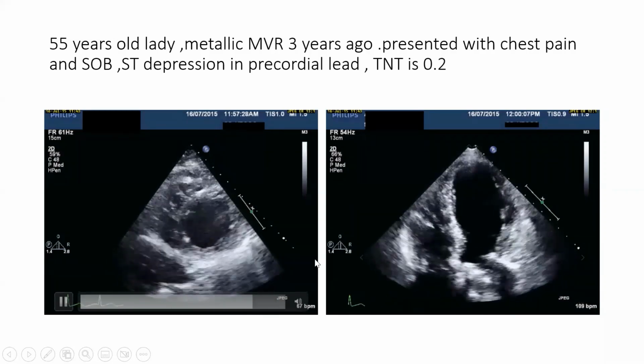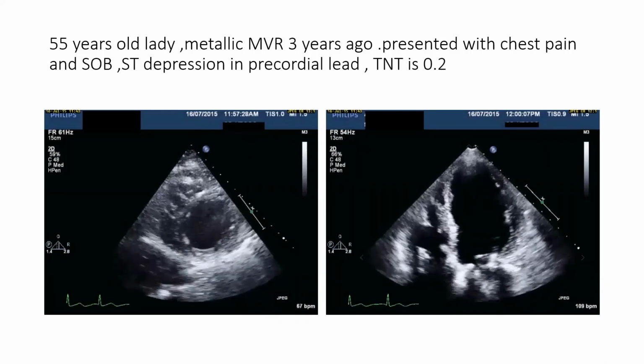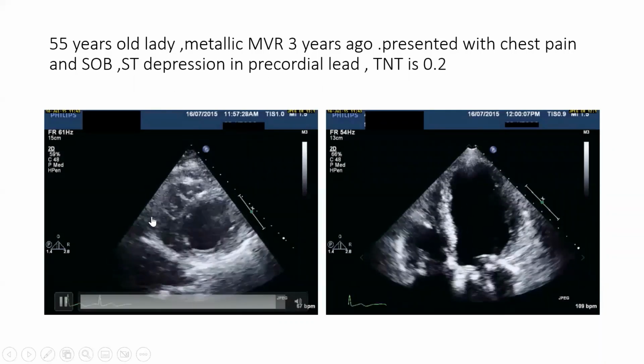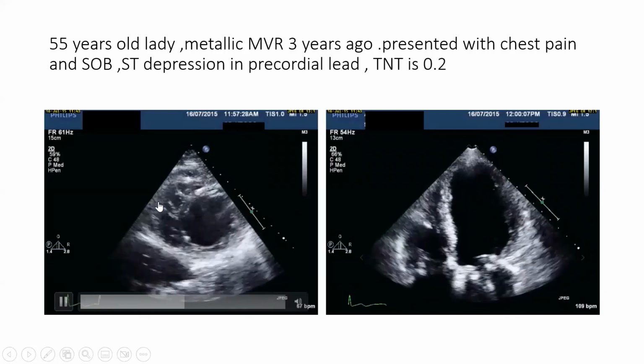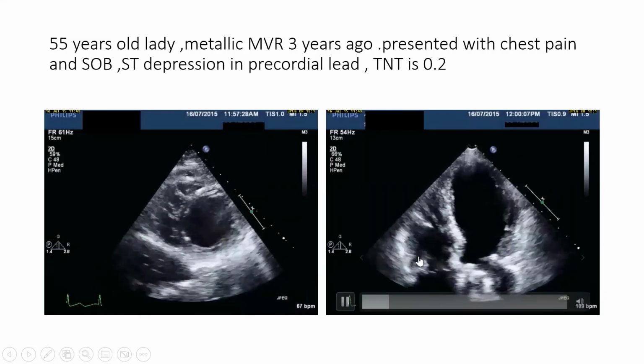What is also worthy of noting is this RV. You see the RV here? The RV toward the apex is hypokinetic. You can see here.